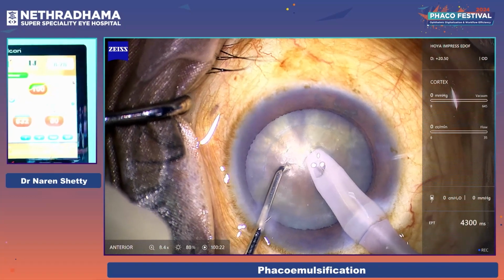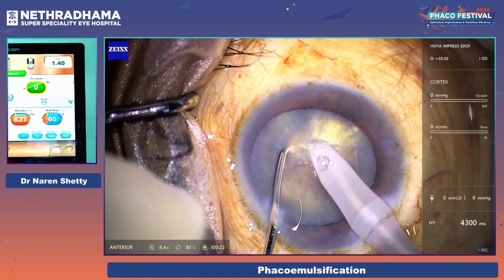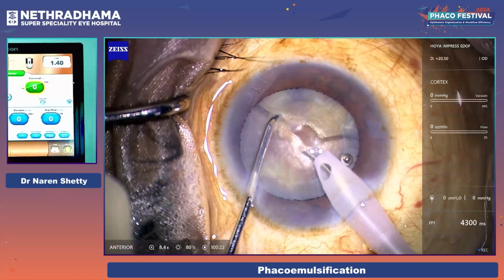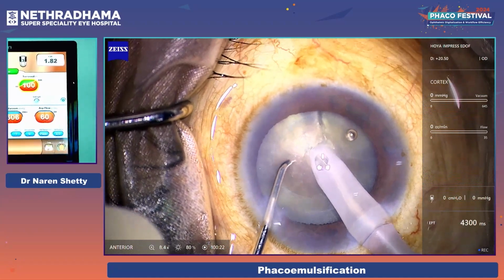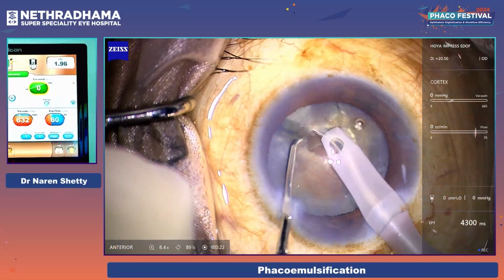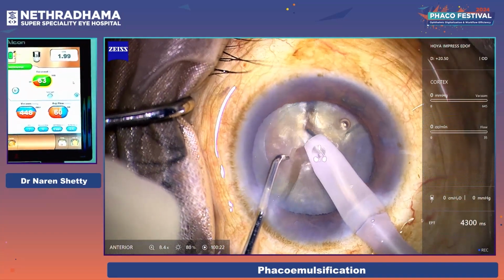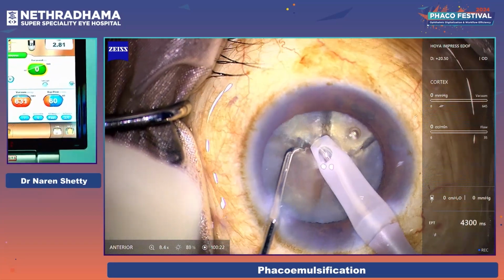What is important is to make sure that a good amount of the tip is impaled. Once that is done, just a quick chop towards the tip and then sideways. Okay? Again, rotate. Do as small chops as possible. So you've got a good hold towards the tip and sideways. And take the chopper deeper and deeper and make sure it's 100% separation. The same thing we need to repeat. Got a good hold towards the tip.